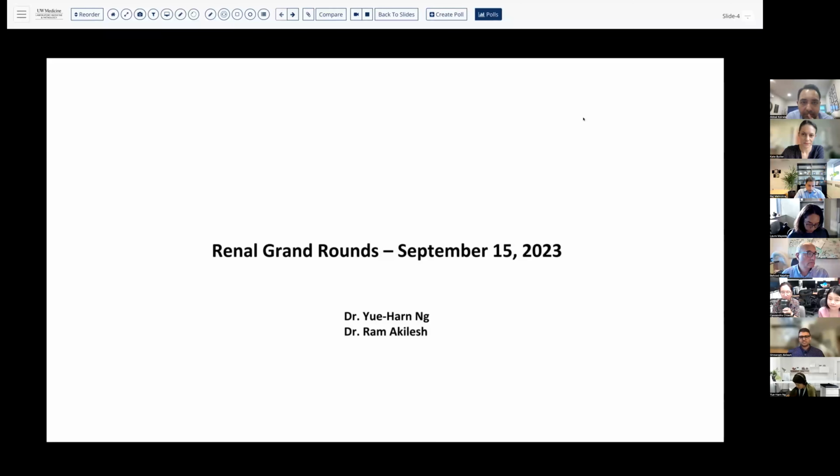So today's case, as Behzad was mentioning, we will start the biopsy conferences in each academic year with somewhat more straightforward or instructive cases to outline the normal features of the kidney biopsy for the new fellows, and then describe classic pathologic alterations that may occur in a variety of diseases.